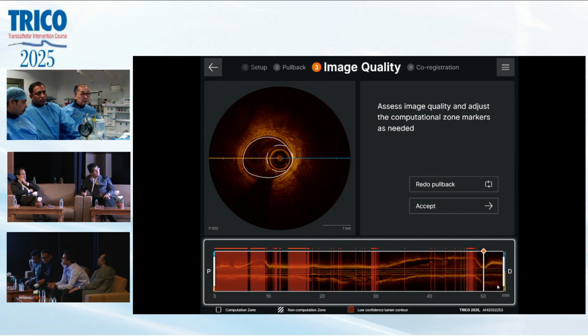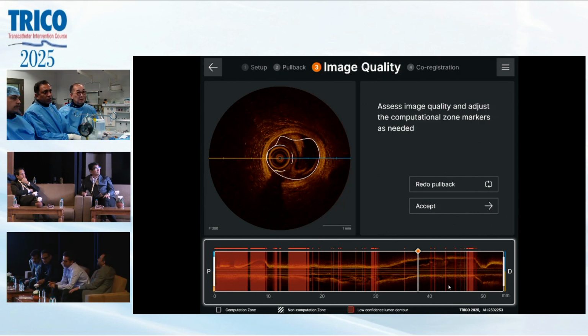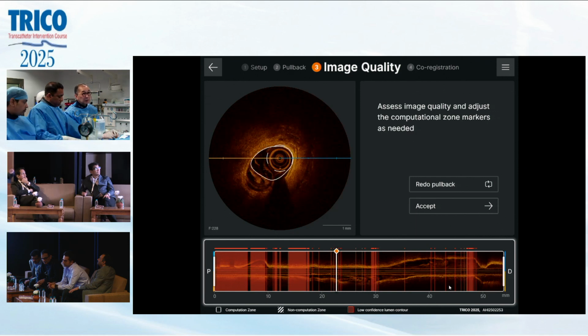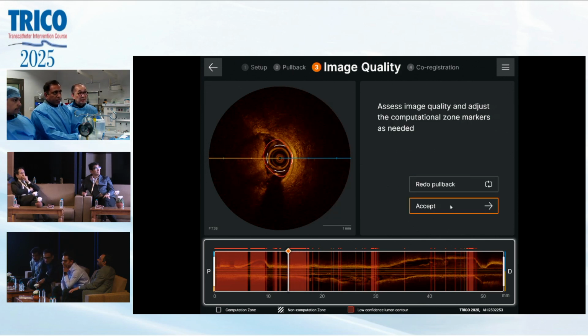The catheter? Yeah, the catheter is good. How about now? Take out. More? Okay, too much. So go back in. How about here?